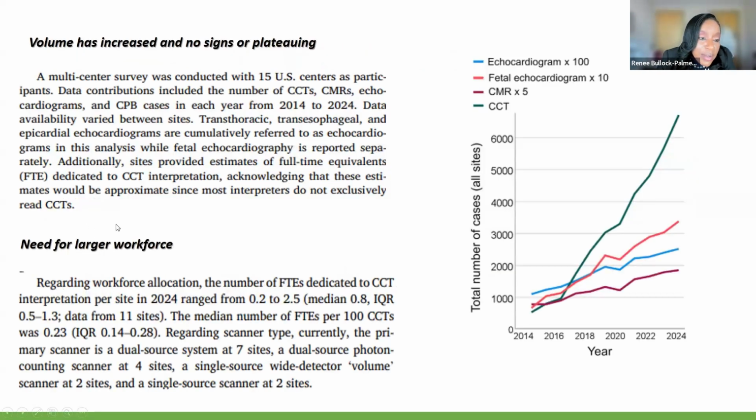And as you can see here, this was over a 10-year period of 2014 to 2024. 15 US centers were studied. And what they saw is that there was a significant increase in the use of CT compared even with CMR and echo, and multiple reasons for this.